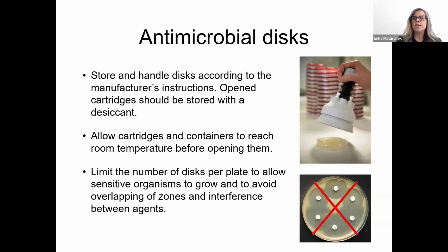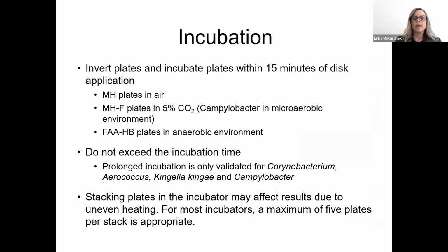We want to measure each agent individually, and there will also be overlapping of zones if we put too many discs on a plate. So we recommend that you put the number of discs on a plate that will make it possible for you to read whole zone diameters. After application of discs, you should invert the plates and incubate them, and that should be within 15 minutes of disc applications. And we already looked at the different incubation environments.